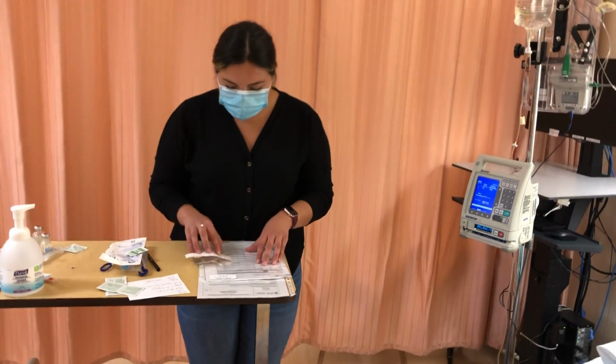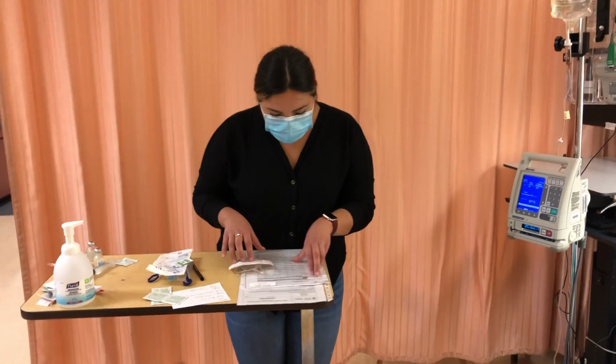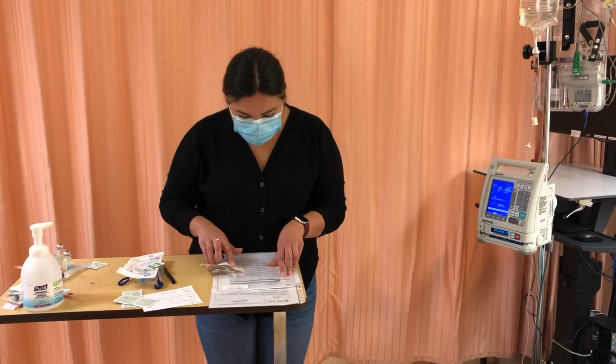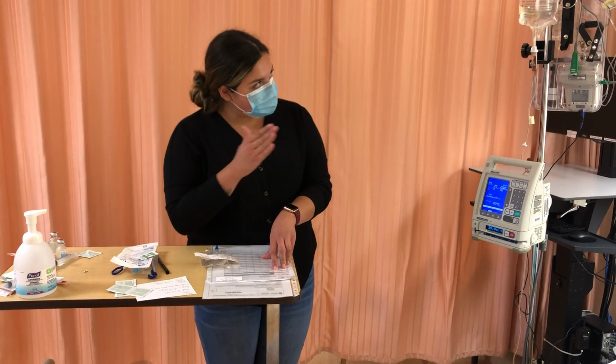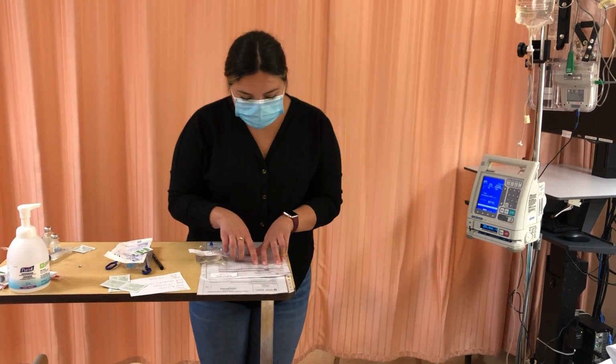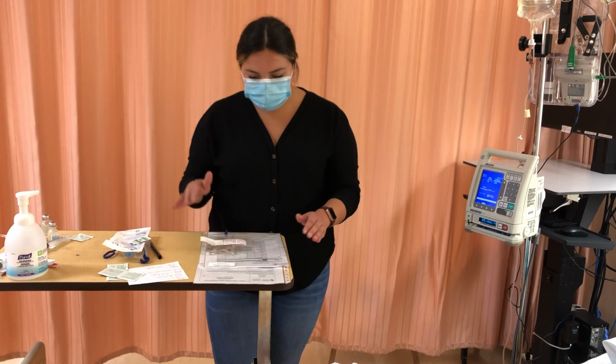So I'm doing my third check. I have Emma Wrightson. I've confirmed that this is Emma Wrightson. No known allergies. We have cloxacillin, 1 gram, to be given IV. I'm giving IV secondary for the secondary line. It's due every 6 hours, and the next dose is due now. So we're okay to go ahead.